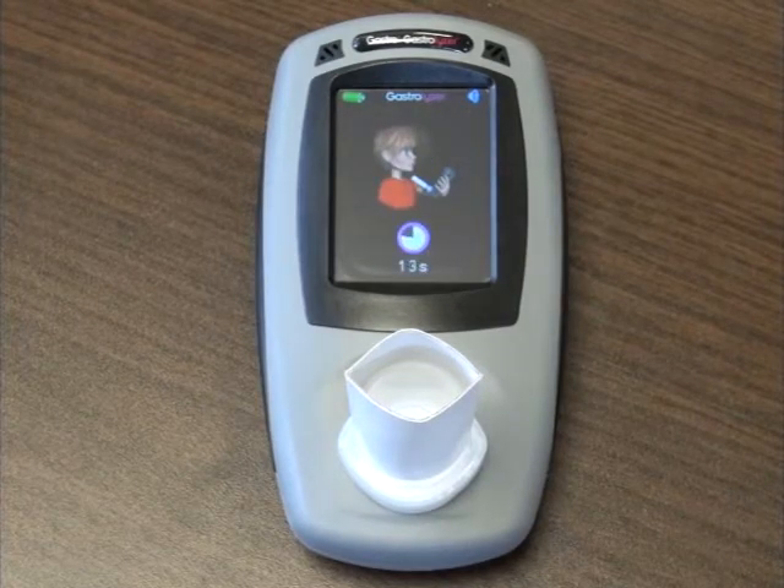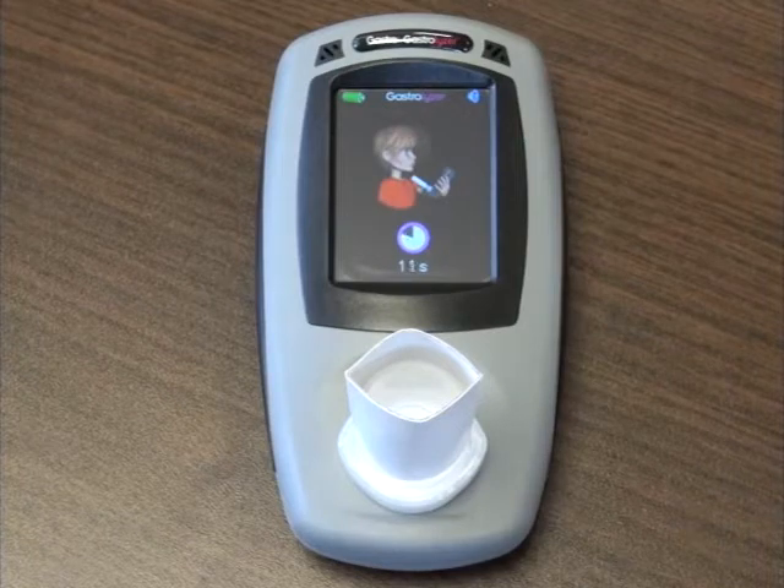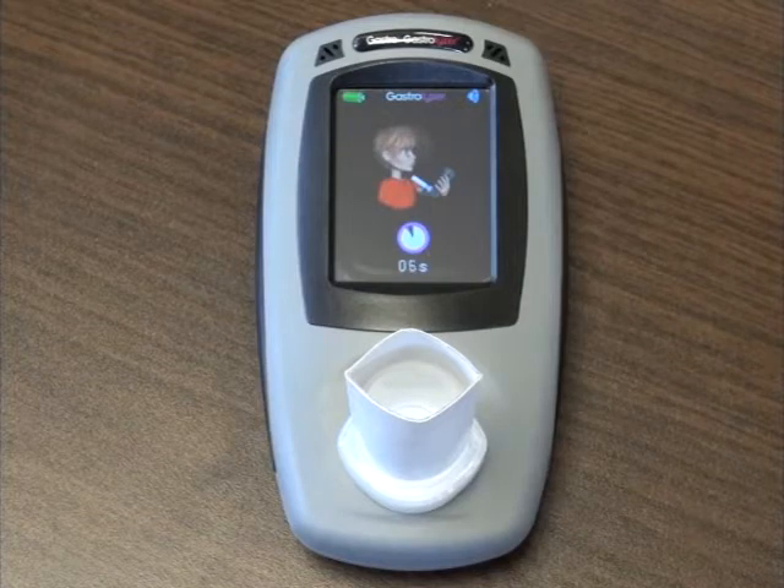A countdown timer will appear. At this stage the patient should inhale as deeply as possible and hold their breath throughout the on-screen countdown. If a face mask is being used, the patient should breathe normally but be encouraged to exhale as much as possible.